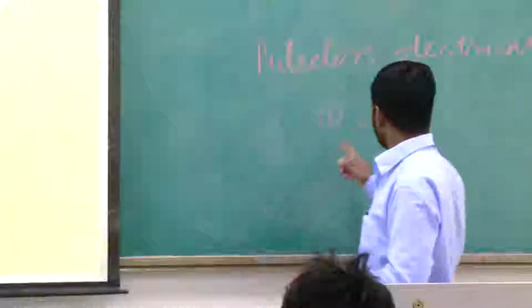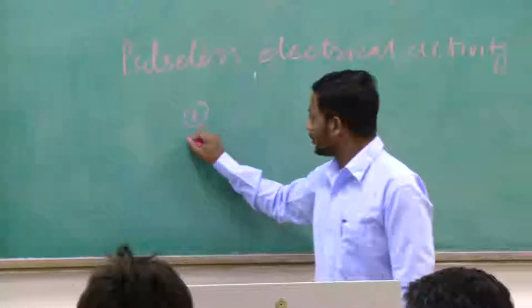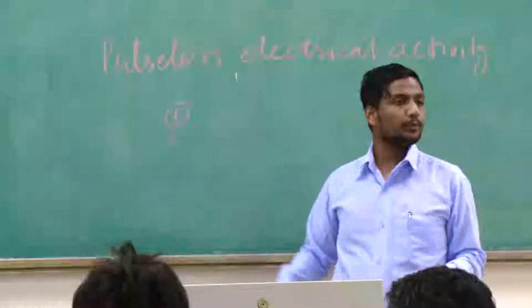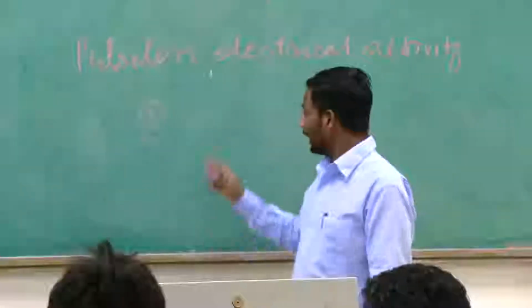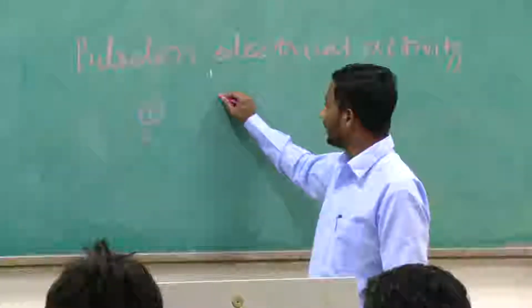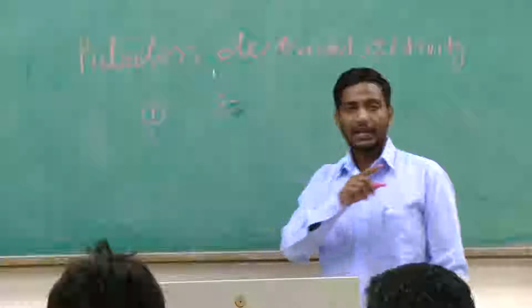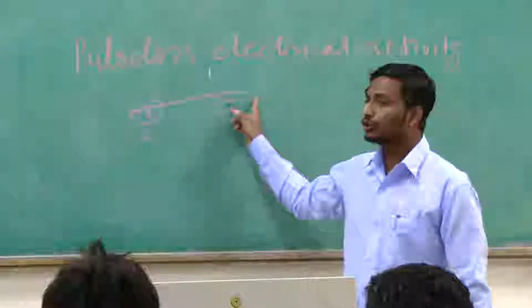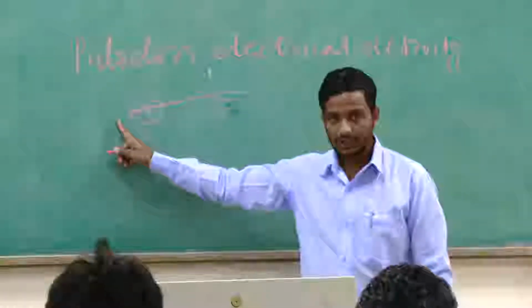So, for example, let's say I am giving you one electrode. Let's say the name is A. If it's working alone, is it going to behave positive or negative? Positive. And in this instance, your body is going to behave as negative. The axis of any electrode always goes from negative to positive. So this is going to be the axis from negative to positive.